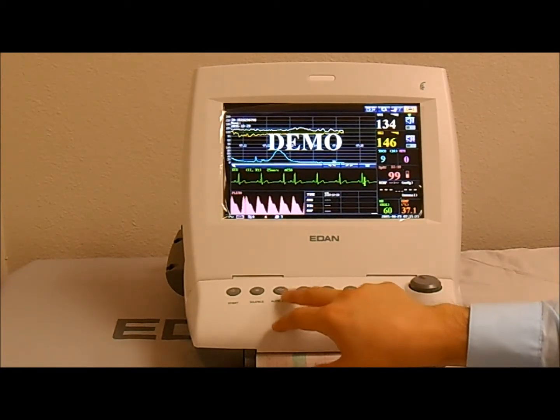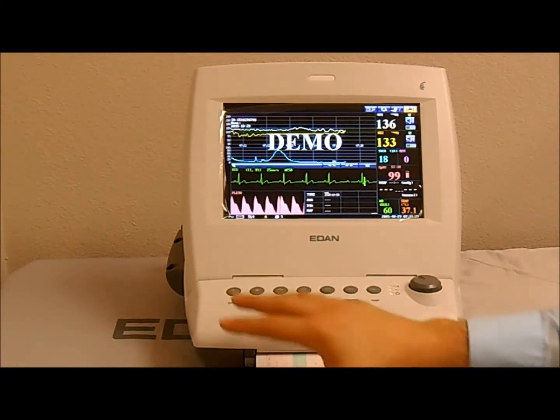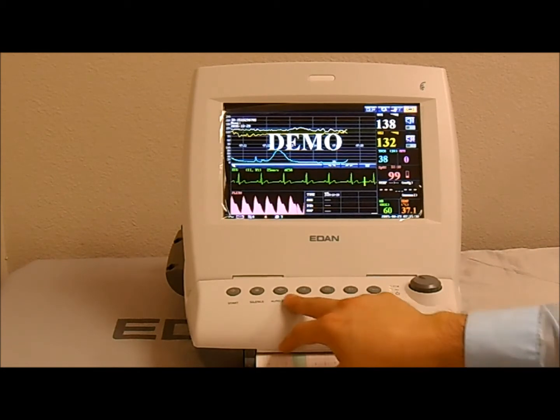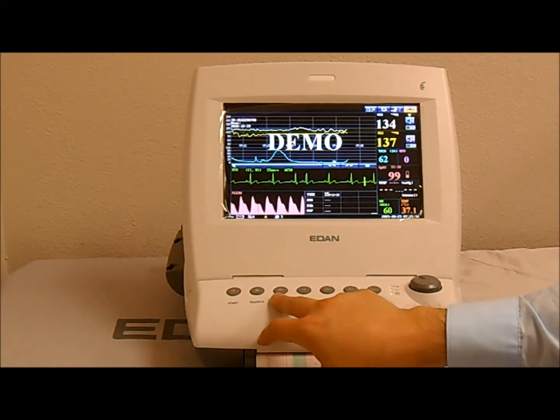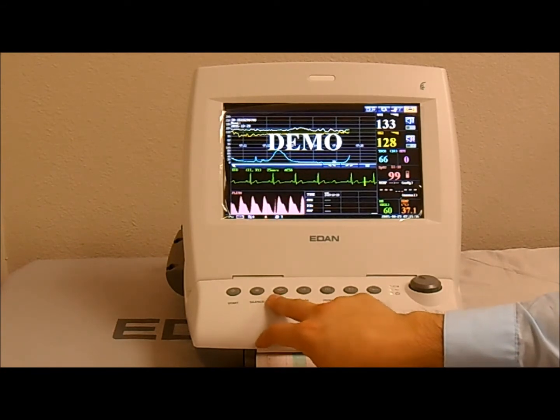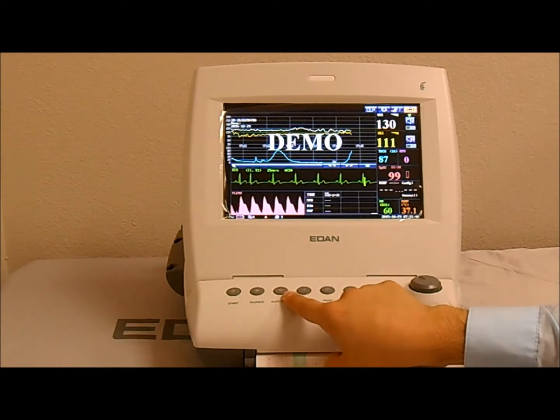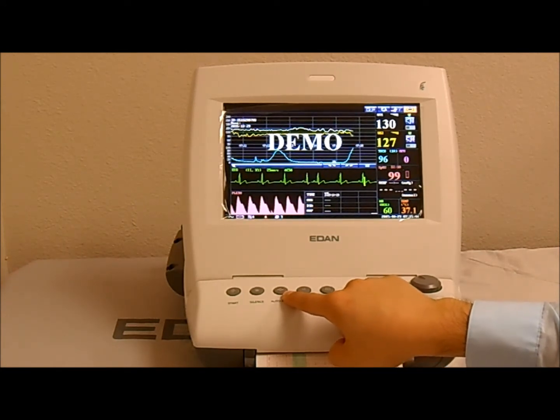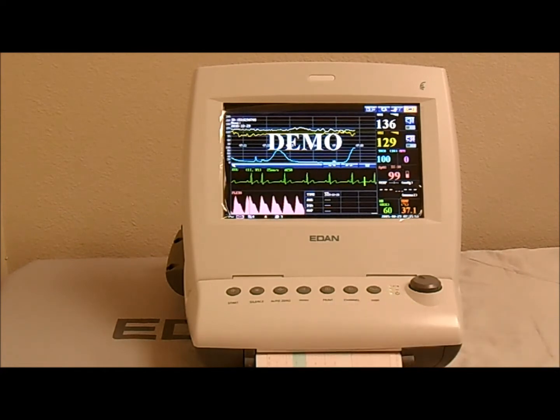The auto zero also occurs when you press the start key. When you press start, it starts a new session and automatically sets the auto zero. So you don't have to press the auto zero key every single time you have a new patient. It's automatically performed when you press the start key. Rather, it's there in case the patient moves and the transducer falls off, so that you don't have to start from scratch, from the very beginning. You only press the auto zero.